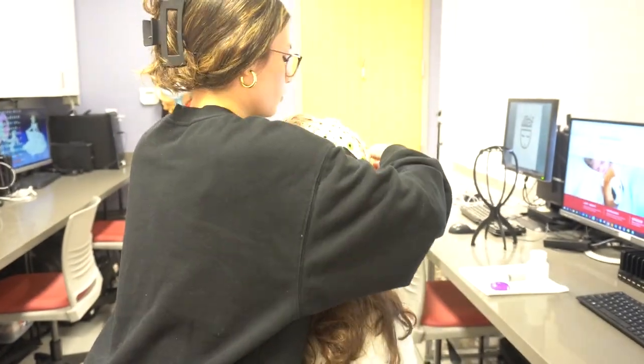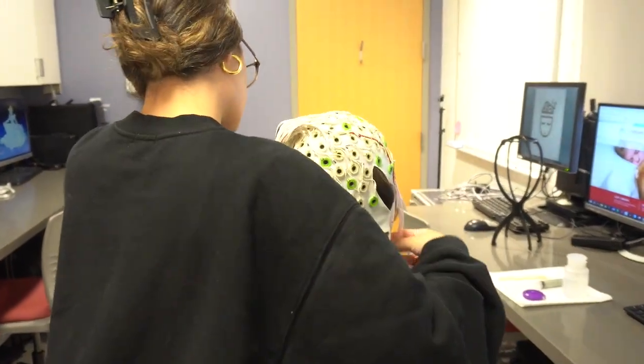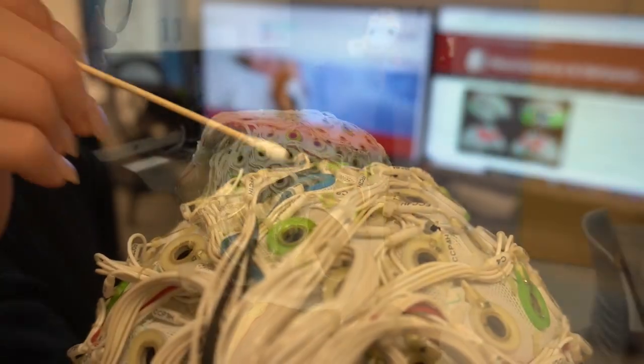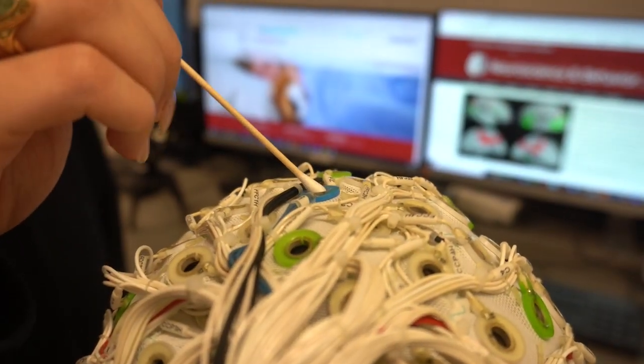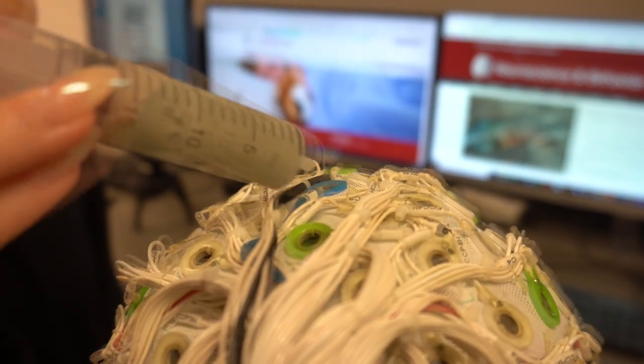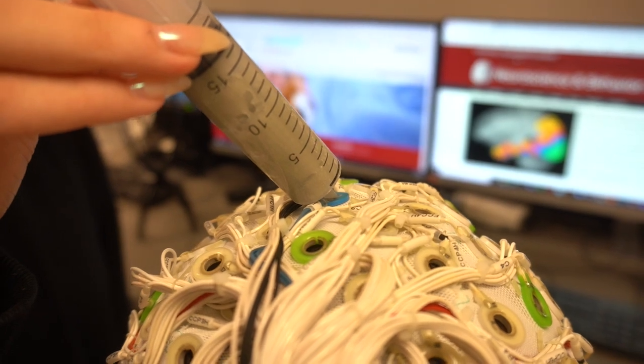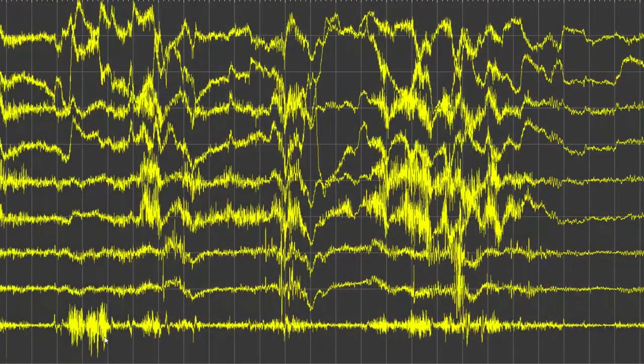The tiny electrical currents of many neurons being active in unison can combine to create a big enough fluctuation to be detected through the skull as a difference in electrical potential between electrodes. Fluctuations detected at electrodes are then amplified, digitized, and displayed on a computer over time. Over time, the fluctuations change, and their changes constitute an EEG recording.